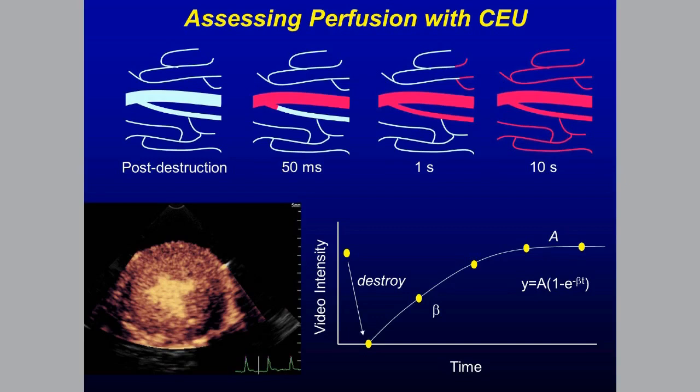Yep. So Monet, there's a question here, number 18. What data is available on saline injection and TR velocity jet? My sense is that it can be very helpful. Is there any evidence that it may result in an overestimation of the gradient? So you want to give some hints on how best to optimize agitated saline?